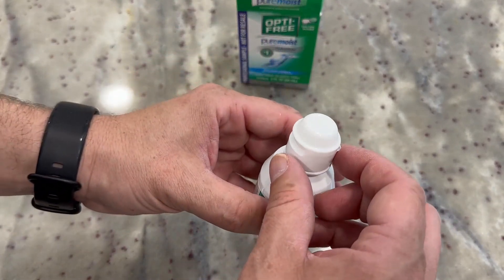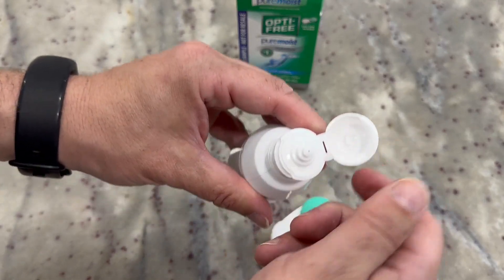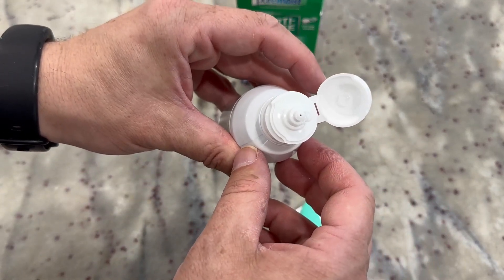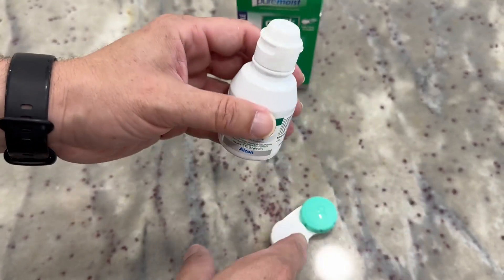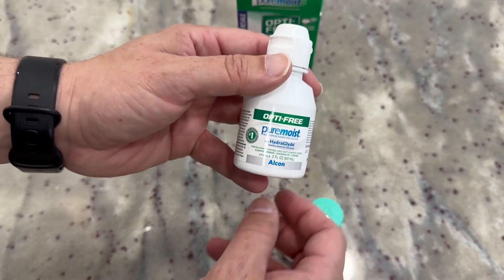The way this works, you have a little spout that you open up, and then you have to actually squeeze a little bit out like that — you can see a bubble coming out there. You squeeze the solution to get it out however you need, putting it on your lenses or into the case.